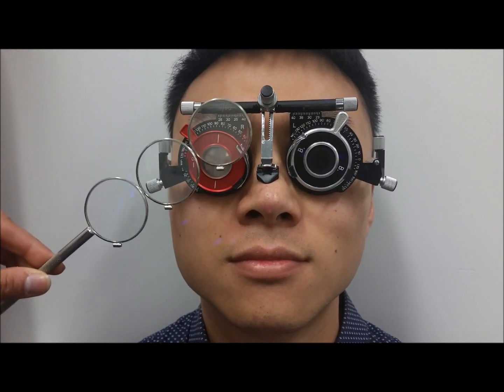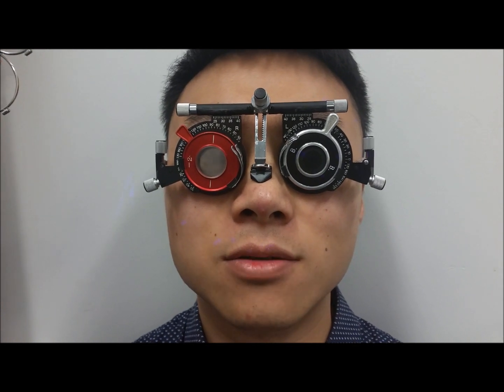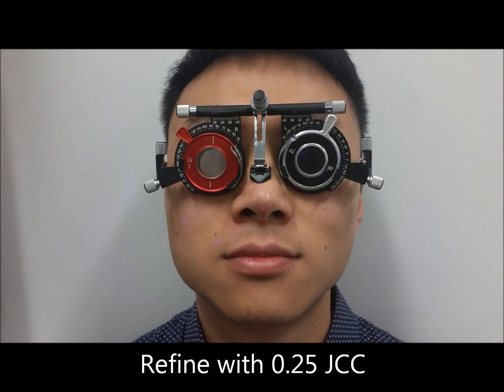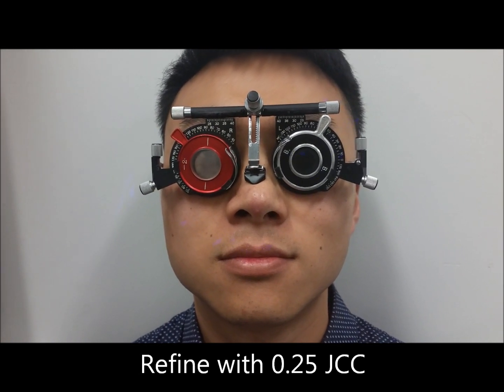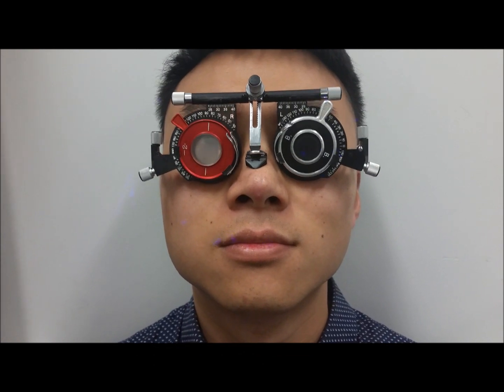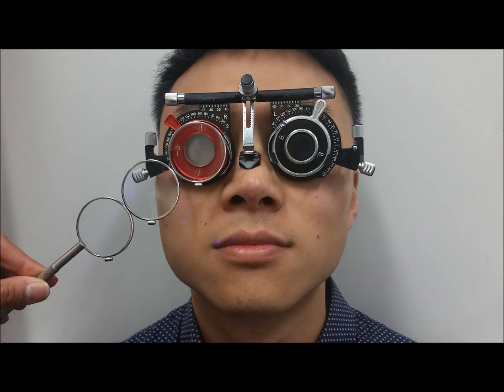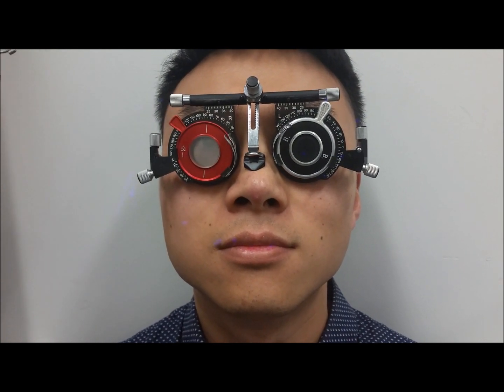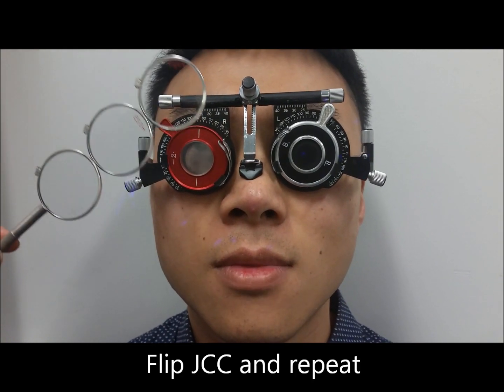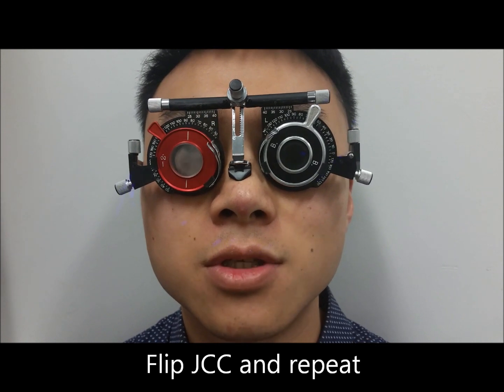Yep, so Hongbin, I just want you to tell me, is it better with or without? Better without. We now try refining with the 0.25 Jackson cross cylinder by superimposing the axis once again over the existing cylinder axis in the trial frames. Yep, so just keep on concentrating on that O for me and tell me, is it better with or without? Better without. And once again, just tell me, is it better with or without? Better without.